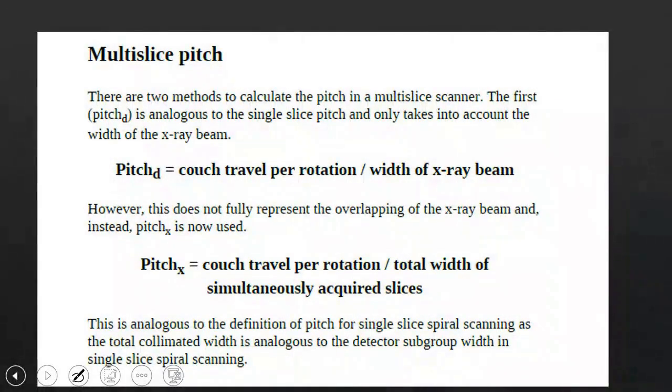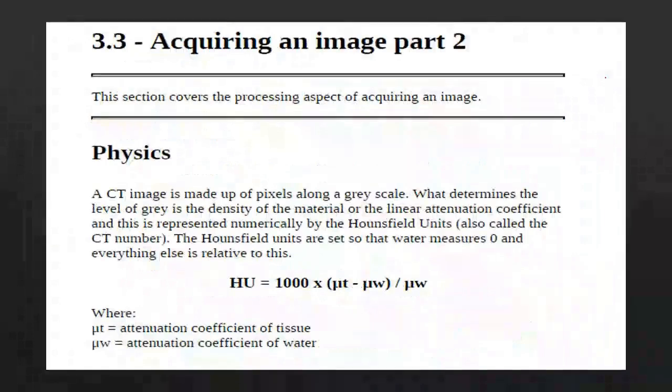We talked about the pitch last time, and we thought it over, right? Or should we revisit it? There is something very important. The man who developed this CT in the 1970s is Godfrey Hounsfield, a biomedical engineer, and he was accompanied by a physicist from South Africa named Cormack. The two of them received the Nobel Prize.